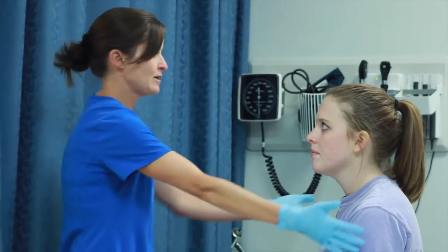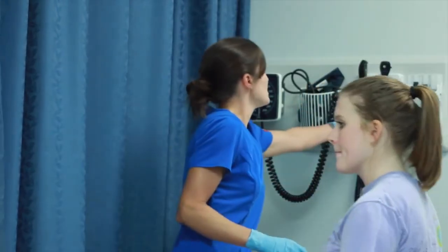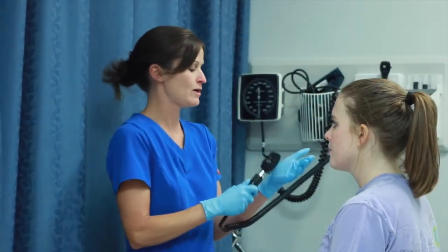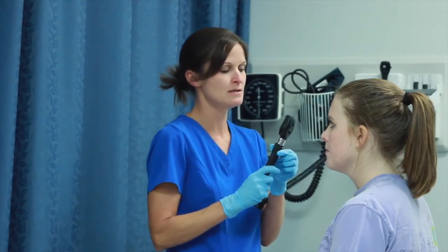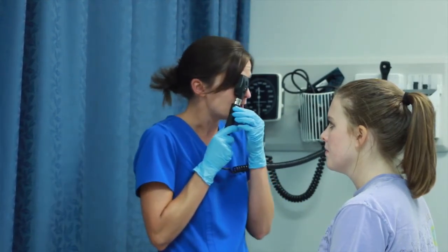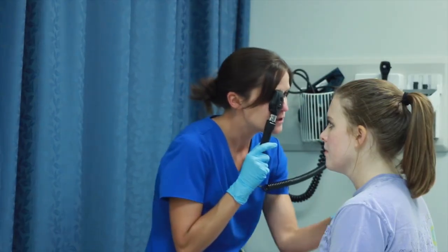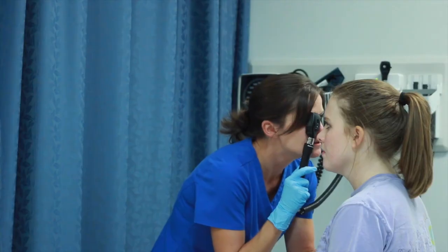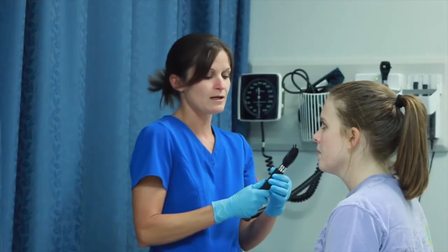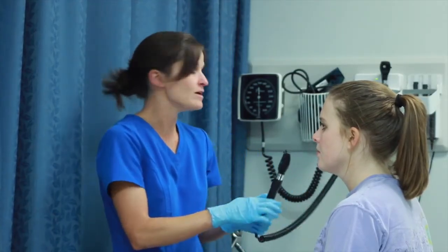Before we move to the Snellen chart, we're going to have our patient look through the red reflex using the ophthalmoscope. This may be for more advanced practice — you take your right eye aligned with her right eye and follow in, finding the red reflex. The light of the ophthalmoscope is placed on the pupil and you follow it in to find the optic disc, which looks like a bright orangey-red color. Through the optic disc you can visualize blood vessels — this is the only place in the body where blood vessels can be directly visualized.